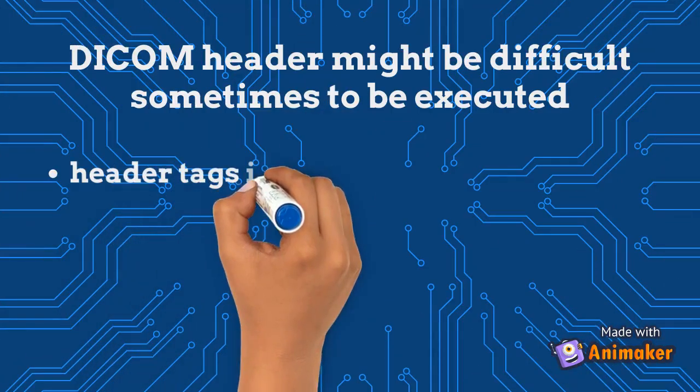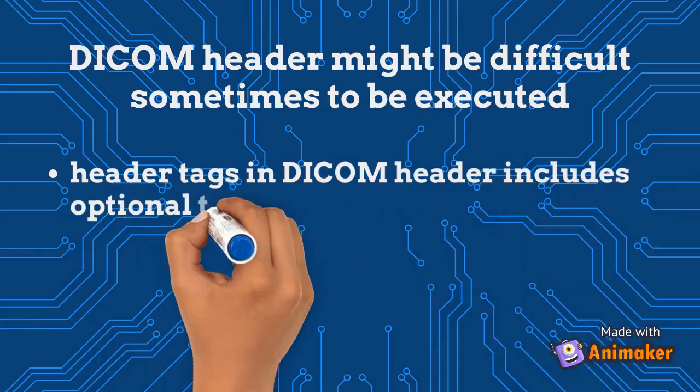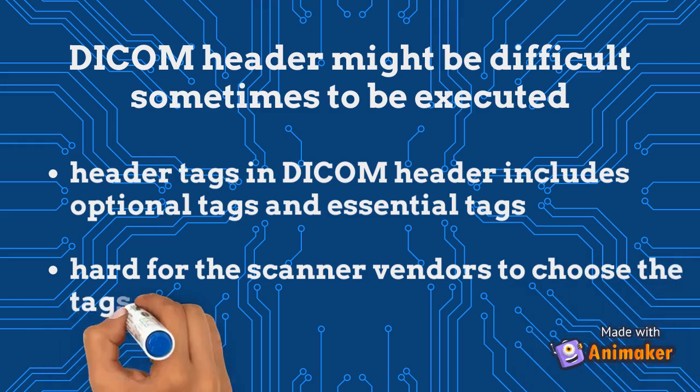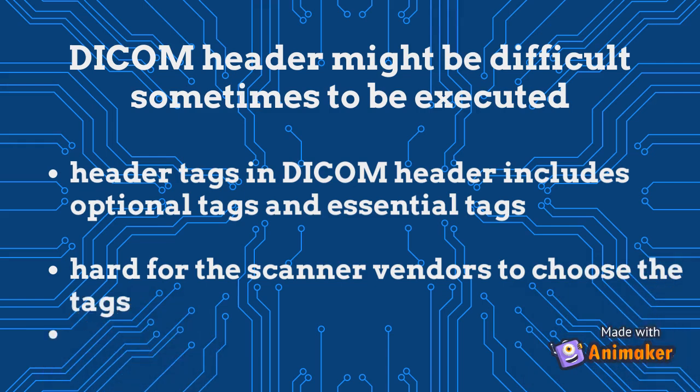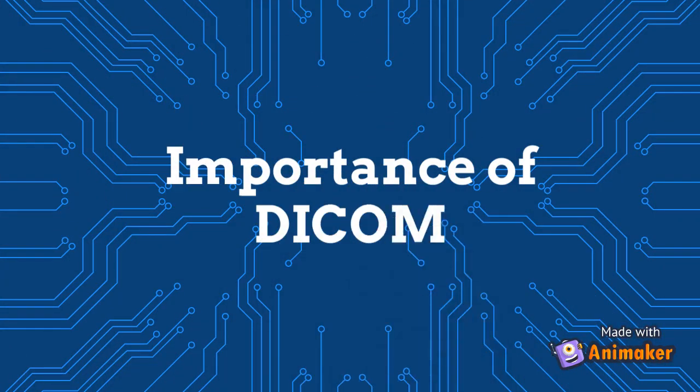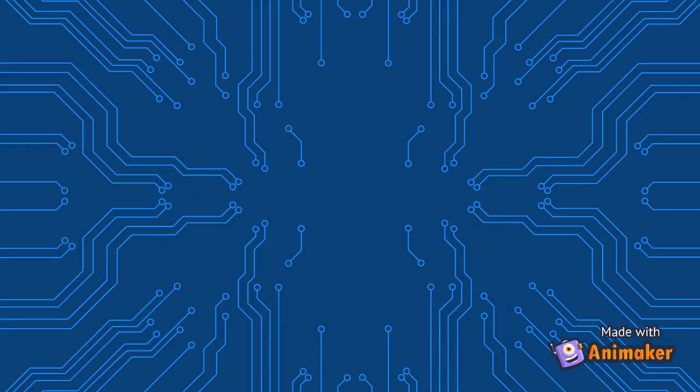Moreover, the DICOM header might sometimes be difficult to execute. Since the header tags in the DICOM header include optional tags and essential tags, it is hard for the scanner vendors to choose the tags. The last part is about the importance of DICOM.